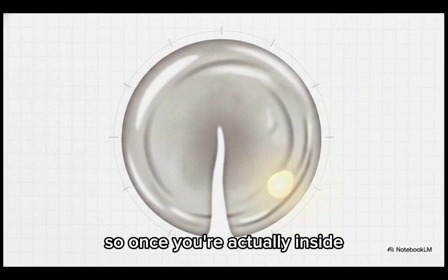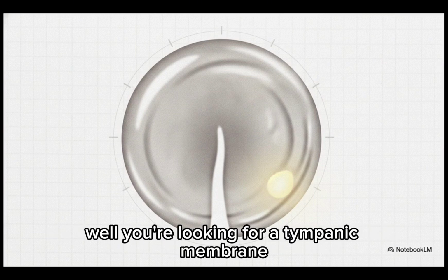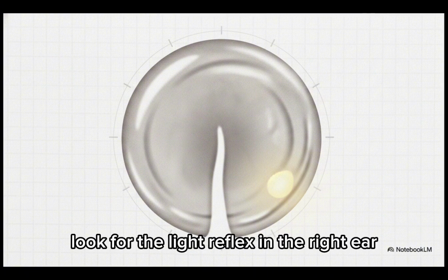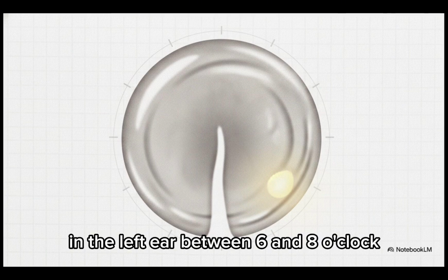So once you're actually inside, what exactly should a normal eardrum look like? Well, you're looking for a tympanic membrane that is pearl gray, glistening, and transparent. And here's a fantastic anatomical trick using a light. Look for the light reflex. In the right ear, that reflection should sit right between 4 and 6 o'clock. In the left ear, between 6 and 8 o'clock.